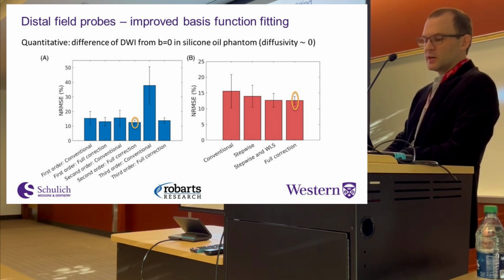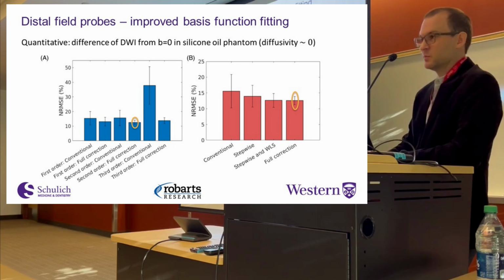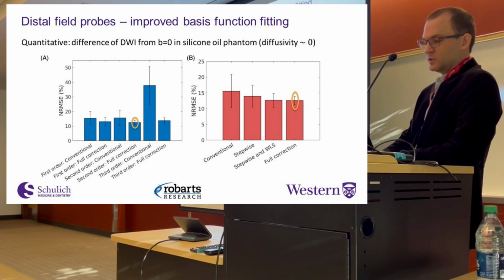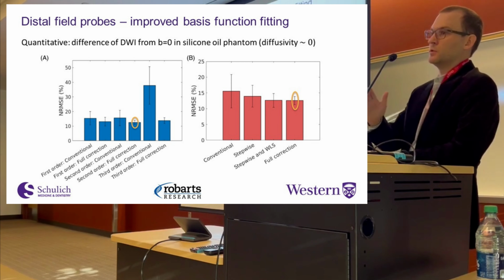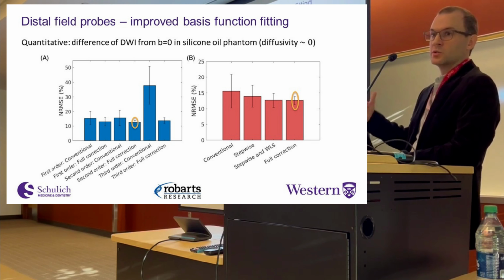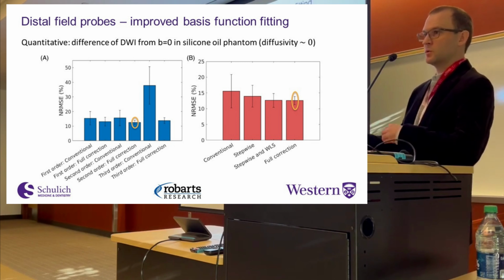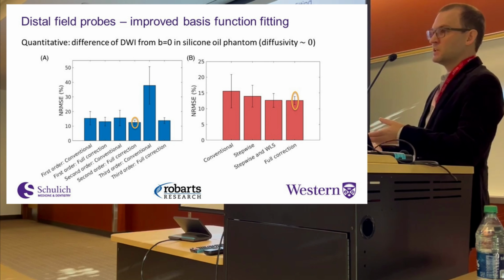And then, we had a couple of things. The stepwise approach that I mentioned, there's also weighted least squares. And then there's another part of the algorithm, which I won't go into here because it's difficult to explain in a short amount of time, which is the full correction. And you can see also that these standard deviations are getting smaller with our correction. This is actually the standard deviation over all the diffusion directions. So the correction's also making things more consistent across directions, which is really important for FA. If there's any sort of systematic error across different directions, that shows up as low FAs becoming higher.